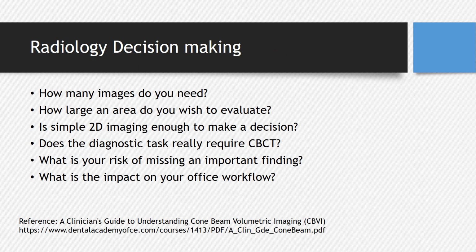So, when you're doing decision making and you're advising a CBCT, it's important to keep in mind how many images you need, how large an area you wish to evaluate, is simple two-dimensional imaging enough to make a decision, does the diagnostic task really require a CBCT, what is your risk of missing an important finding, and what is the impact on your office workflow. So, these are important decisions which have to be kept in mind before a scan is advised.